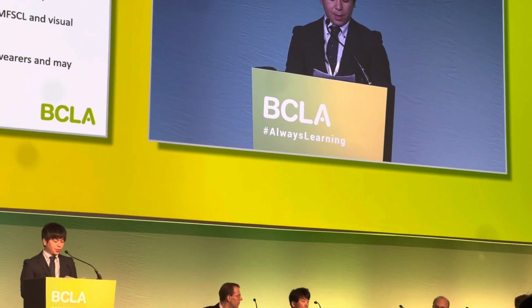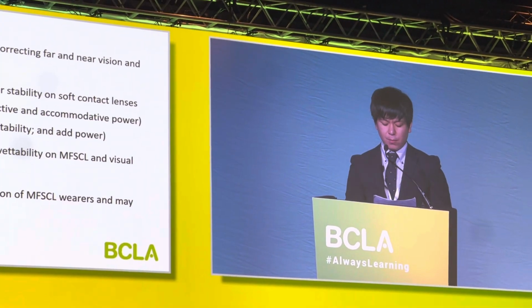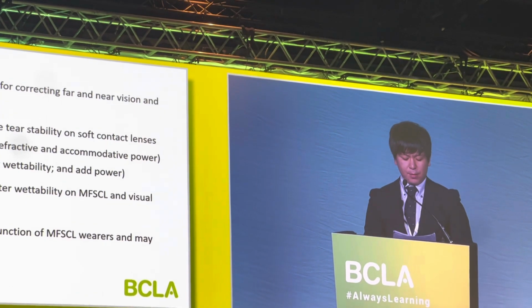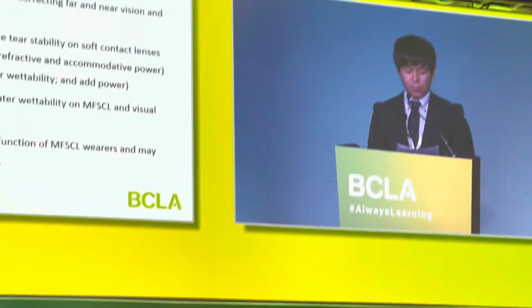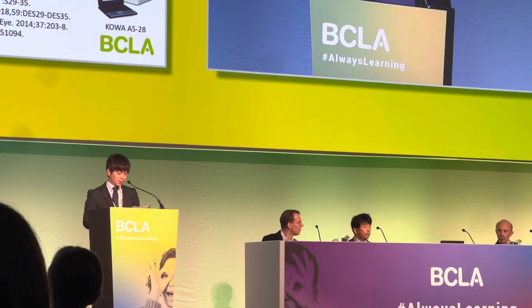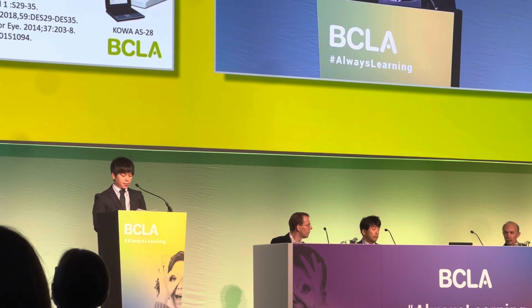It is sometimes challenging to evaluate the visual function of MFSCL wearers and may necessitate new tests of visual function for MFSCL. I will explain the functional visual acuity (FVA), which is one of the evaluation variables in this study.